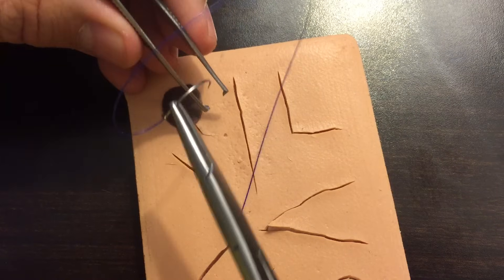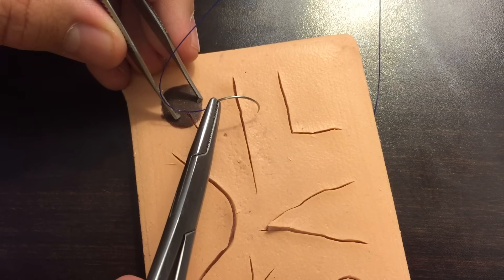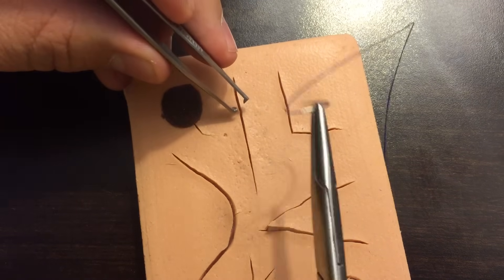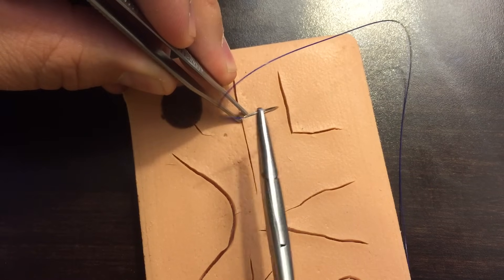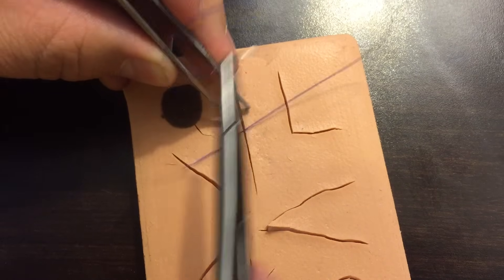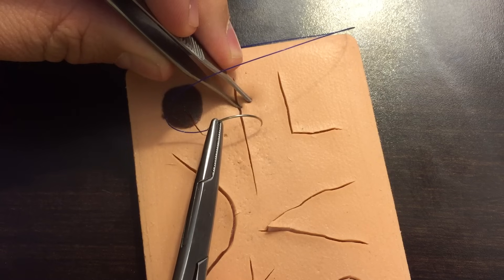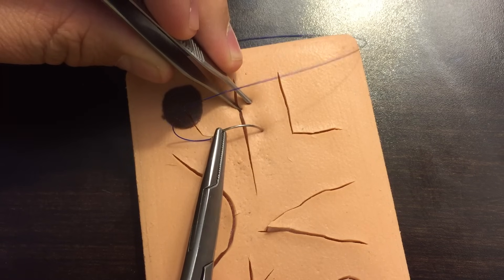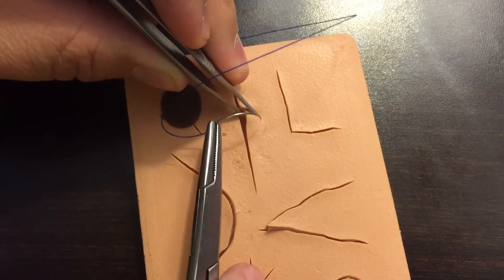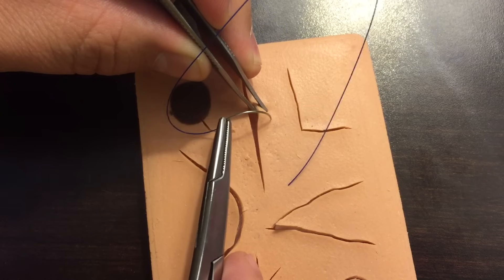When you are suturing, you want to make sure that your needle is entering the skin at a 90-degree angle. A big mistake many people make is entering the skin at 20 to 45 degrees. You really want to rotate the needle over so it enters at 90 degrees, and as it gets to depth, you start to rotate your wrist, driving it through the rest of the way — 90 degrees, rotating, keeping the depth appropriate.